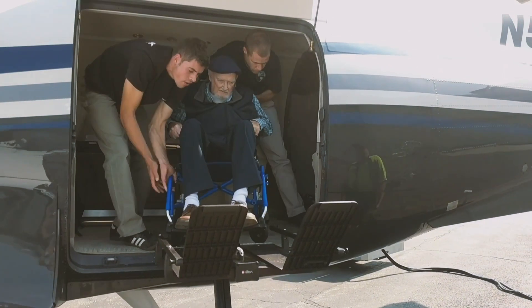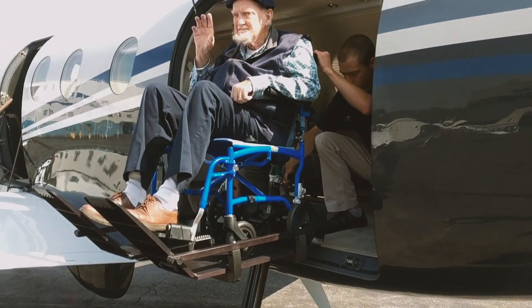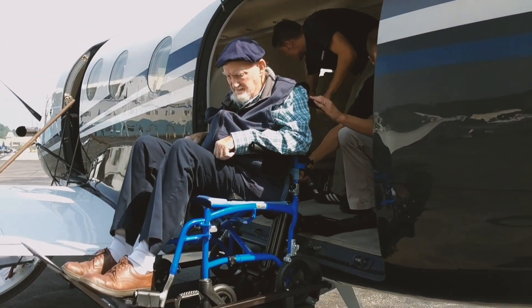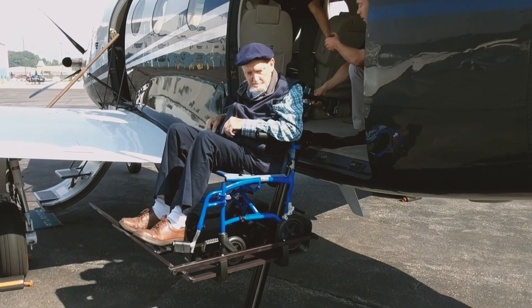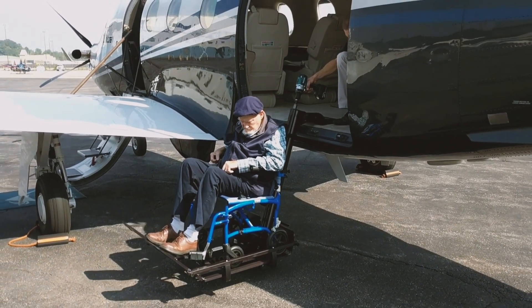The electric drill solution saves weight and eliminates many possible points of failure. However, he carries two drills with the lift kit to avoid getting stuck if one drill fails. Because the system is not permanently installed, no regulatory approval is required. All of the hardware fits into two carry bags and it can be carried as cargo and used at the destination.